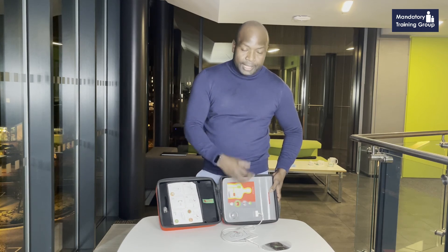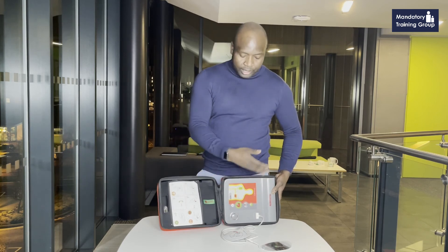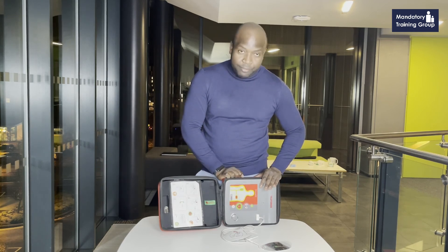Press the button, it delivers the shock, then you carry on with chest compressions, and it will tell you to stop again to analyze. So it's very simple to use. Even if you haven't used it before, if you follow the instructions, you should be able to save someone's life.